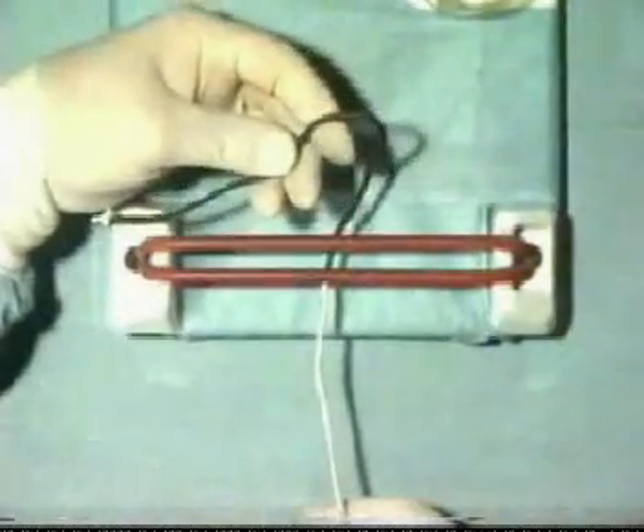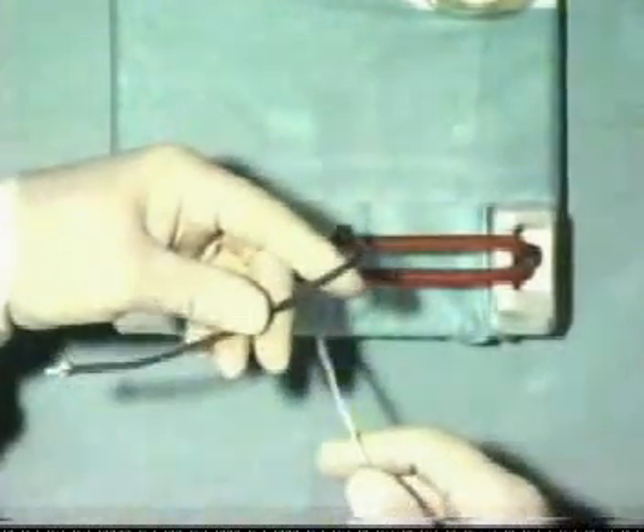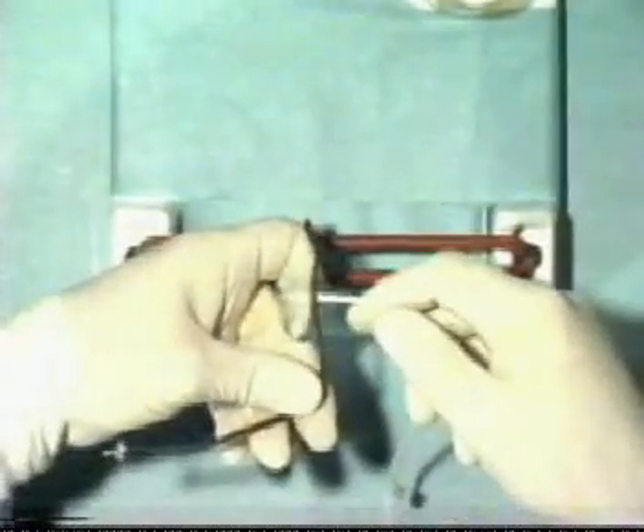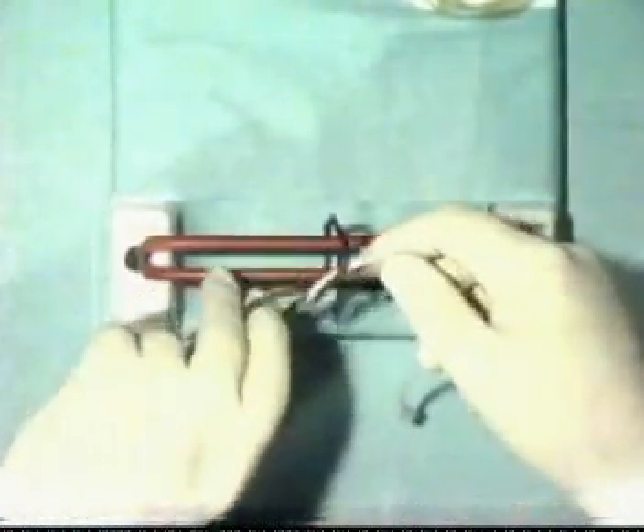We will now tie one in slow motion. Take the shorter end and tie the index finger knot as seen here, bringing the black suture under the white one, and then securing and snugging down by pulling the black end towards you.